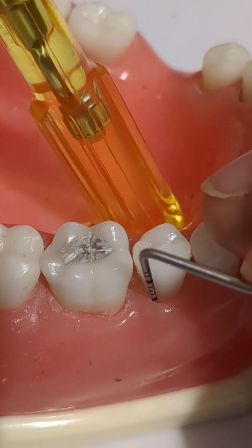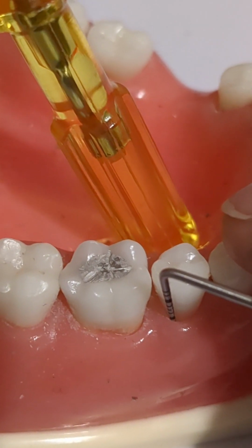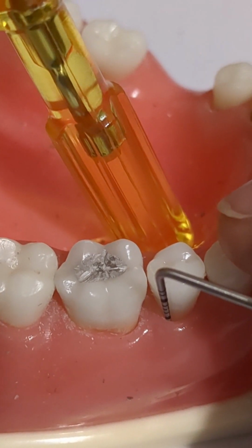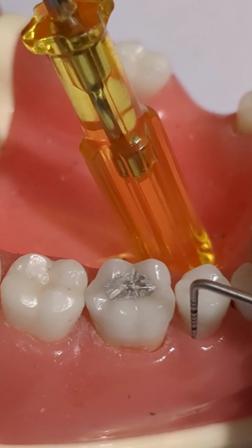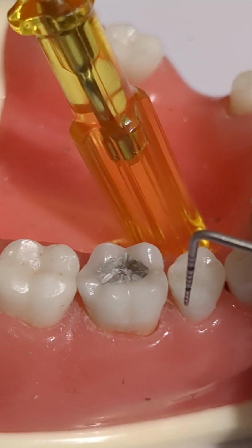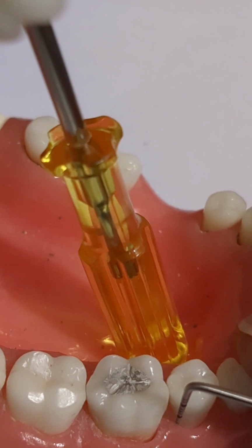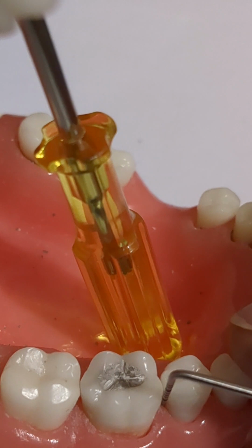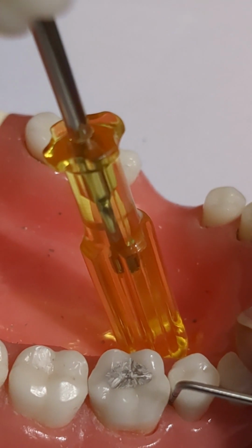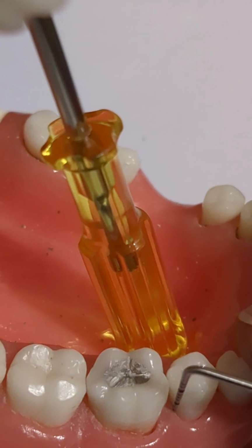When probing interproximally, you tilt the probe 10 to 15 degrees into the col space. So I am going to begin probing to show you how to put the probe into the col space. Tilt ever so slightly into the col space, as so, and then you walk back.